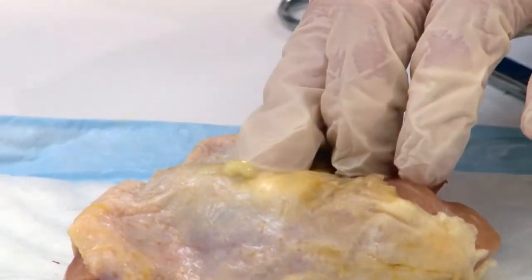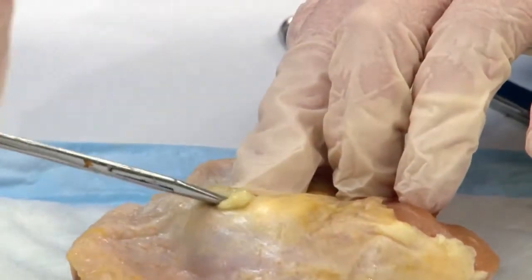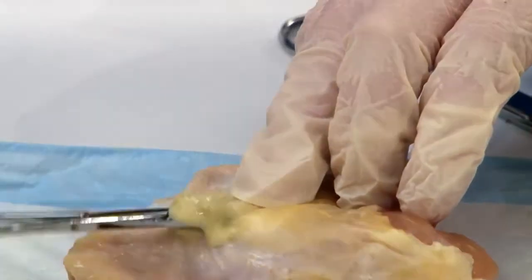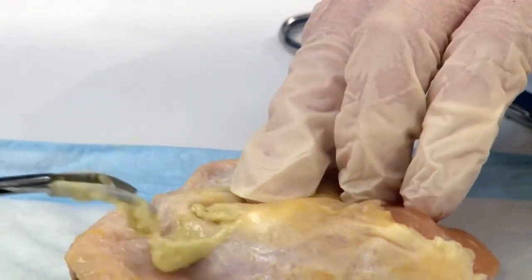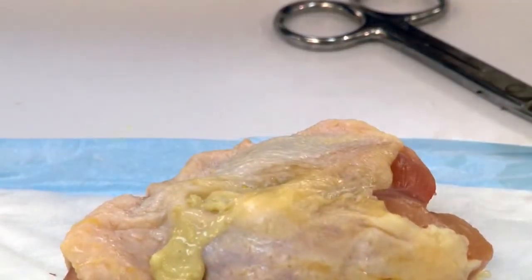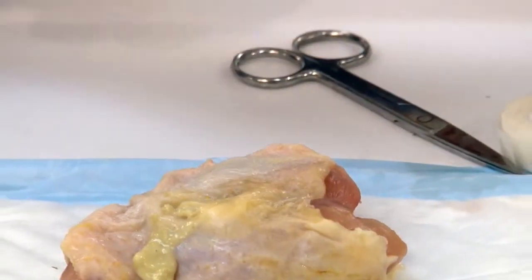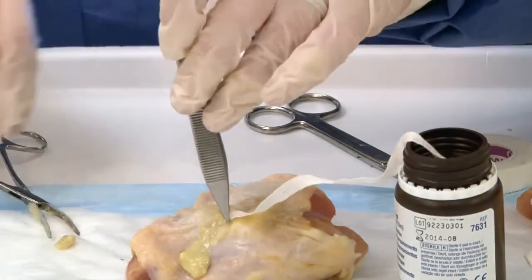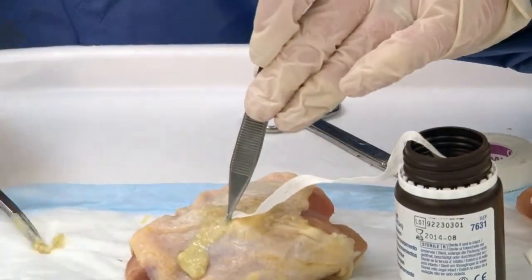I'm going to take a curved hemostat and explore the area. Make sure to break it up really well. As you can see, that pus is really coming out. And I'm going to use iodoform packing to pack the Bartholin's gland abscess.